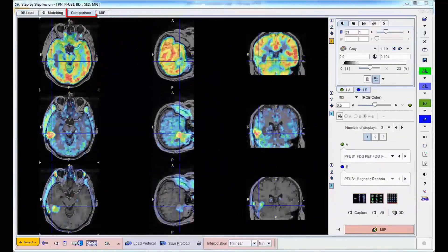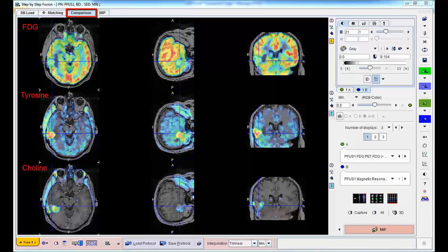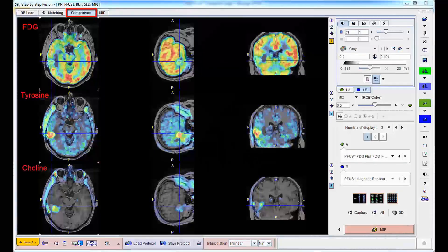The result is shown as a parallel comparison of the three PET images overlaid on the same reference MRI. Clearly, all registrations were successful, and all tracer uptakes have an exact anatomical correspondence.